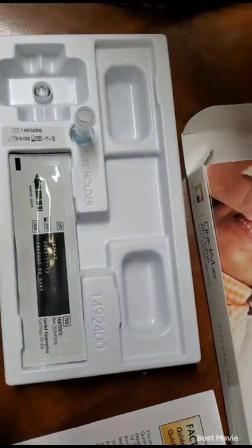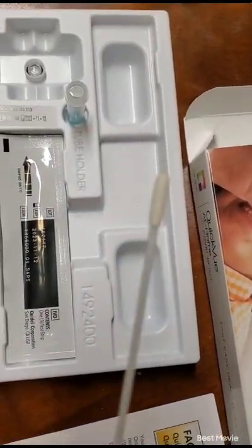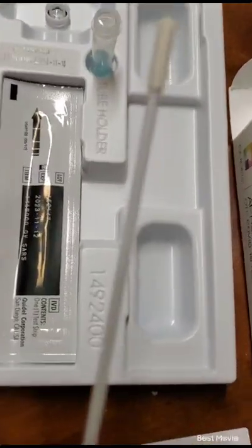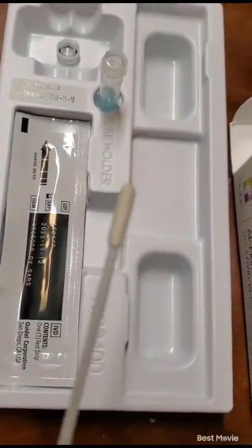Make sure you don't touch that. Now this is what you use to swab your nose. You stick it in each nostril and you swipe it around at least three to four times.